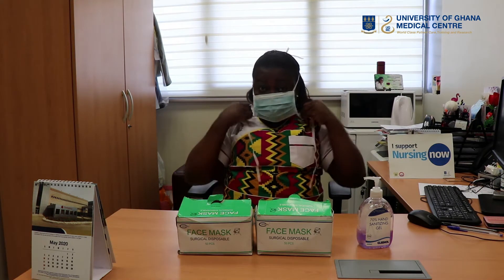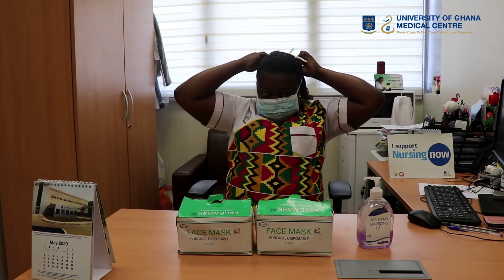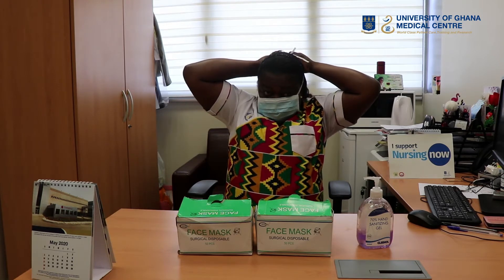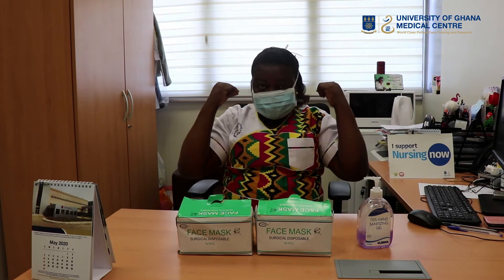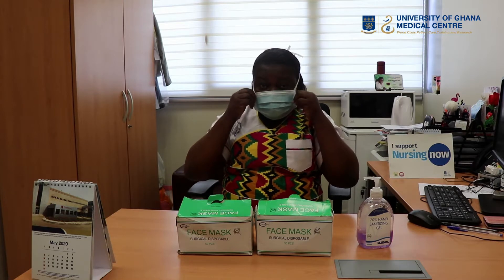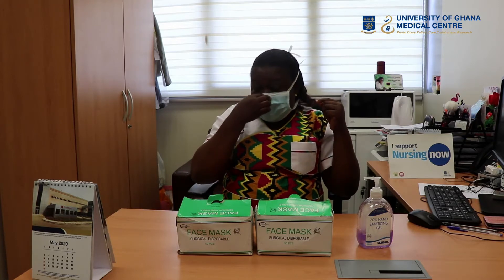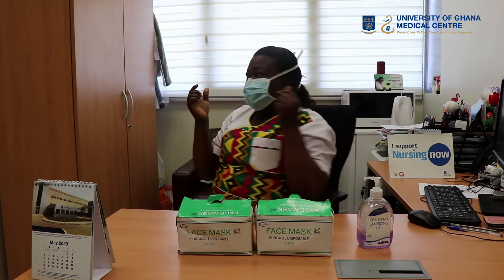Then you tie the upper one above in a bow tie fashion, and then tie the lower one down, making sure you don't cross. We don't cross for a reason — so that when there is a splash and you want to take it off, you just remove the bow tie fashion. Then adjust the face mask to fit the face, pull to cover the chin, and press the string at the bridge of the nose to hold it tight.